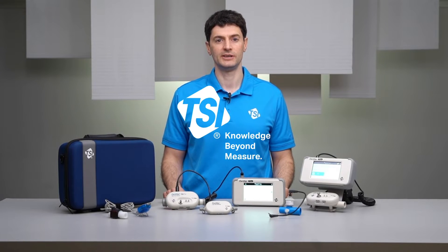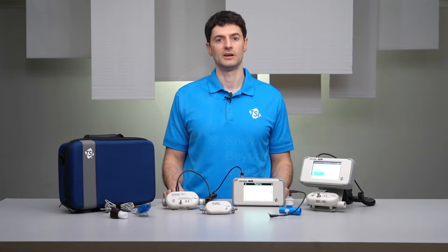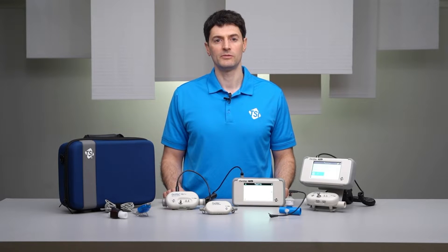Welcome to a training video on TSI Certifier Flow Analyzers. In this video I'll provide an overview of the Certifier Plus Flow Analyzer test system.